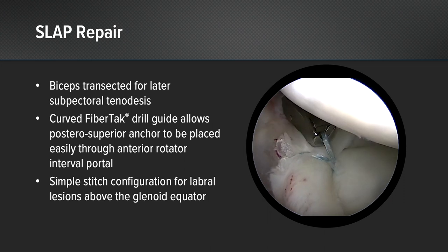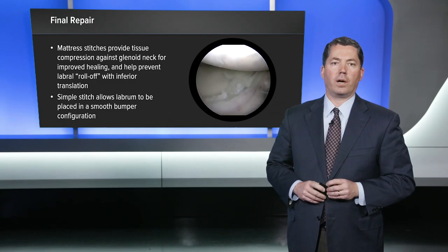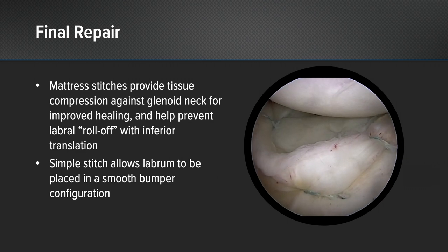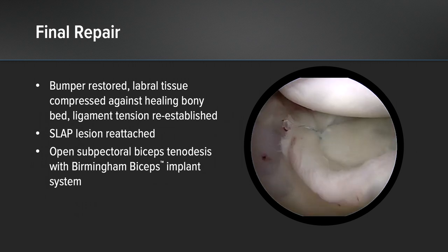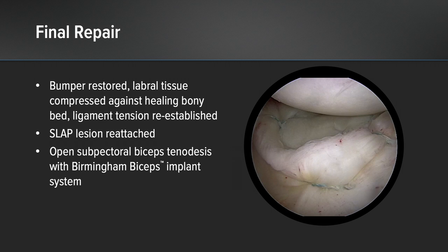As you can see, we get a nice superior labral repair. In terms of final repair, we have a mattress stitch at the lowest portion followed by a simple stitch that rolls the labrum up and forms a nice bumper. This alternating configuration allows for restoration of the bumper, maximum compression of labral tissue against the glenoid neck for better healing, and ligament tension re-established by the inferior glenohumeral ligament being pulled back to the glenoid neck.